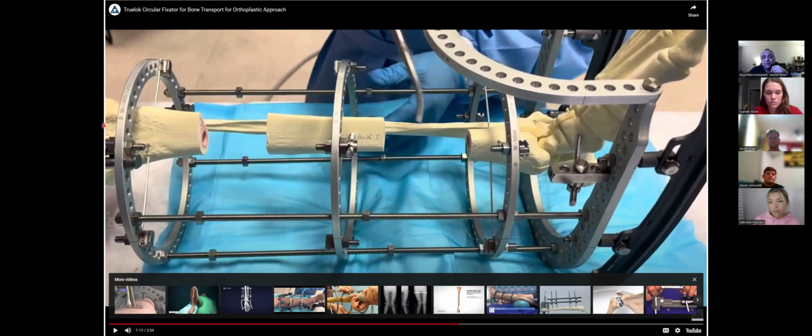Some surgeons recommend inserting an intramedullary nail. In the picture I showed you, I told you to ignore that intramedullary nail. It will help with the alignment, but since these wires here are holding this little segment very tightly, there will be a fight between these wires and that intramedullary nail to overcome each other's force. This one wants to go in this direction based on the wire. The intramedullary nail wants to bring the middle segment in this direction. So in the end, it is the middle segment that is disrupted.